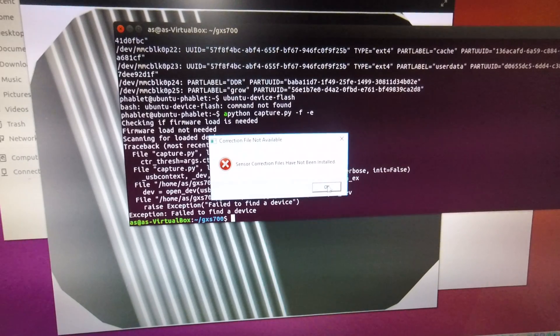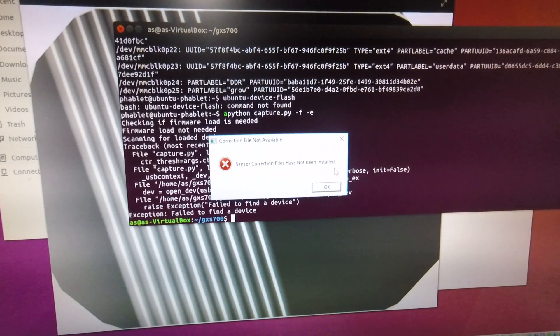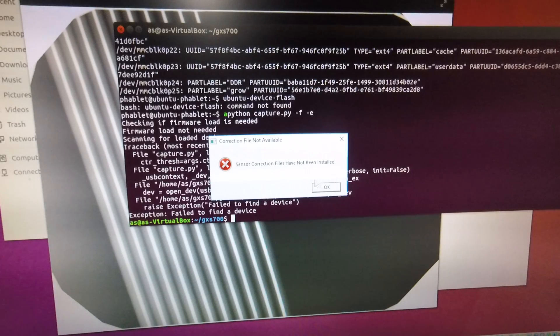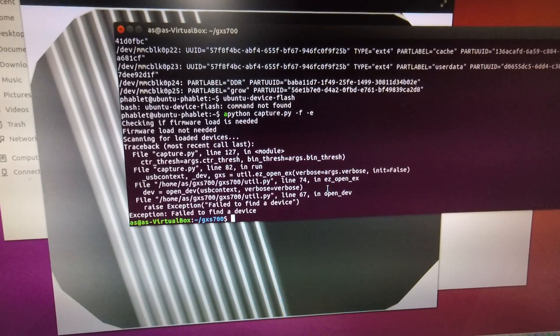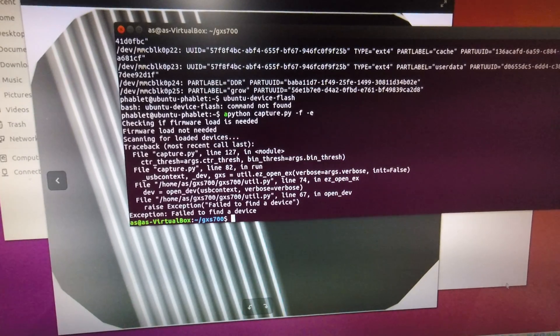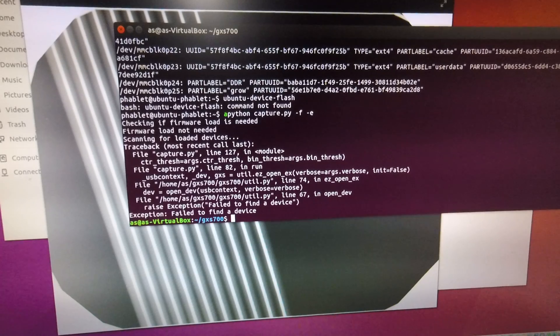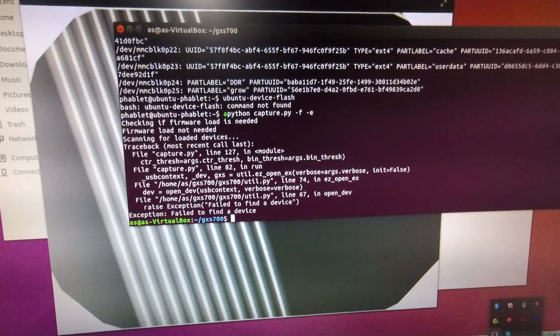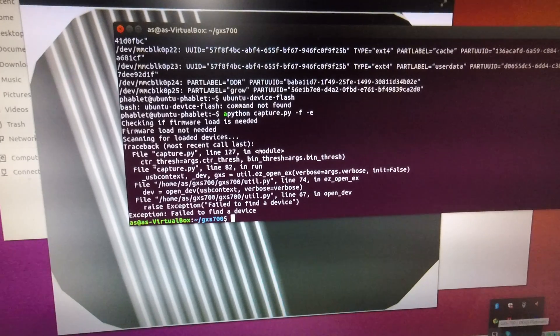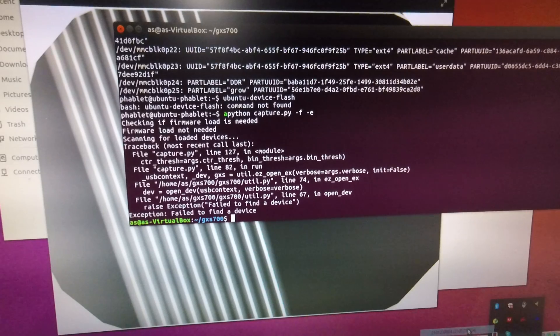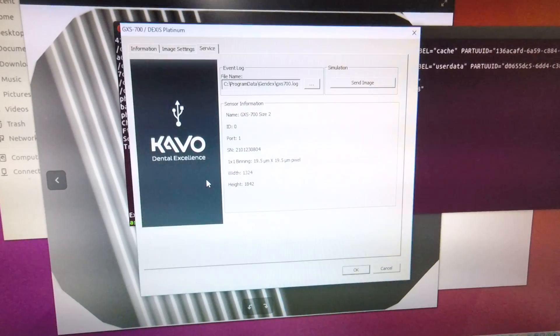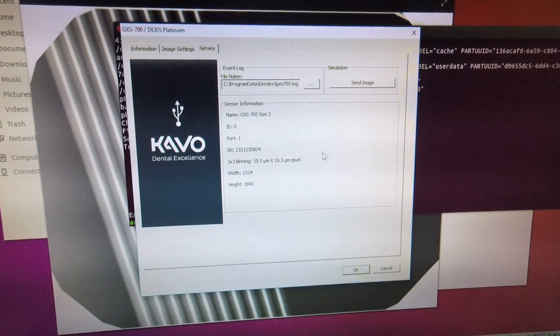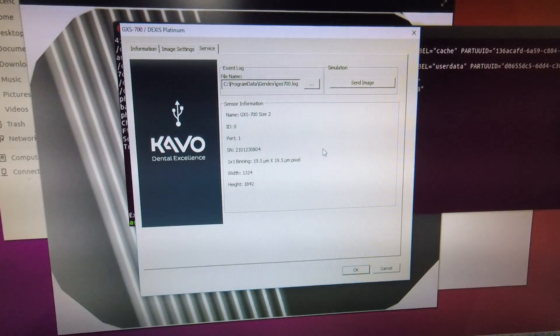Now the Gendex drivers have been installed but sensor correction files have not been installed. Those sensor correction files contain the flat field and dark field and defect map correction files for the Gendex sensor.